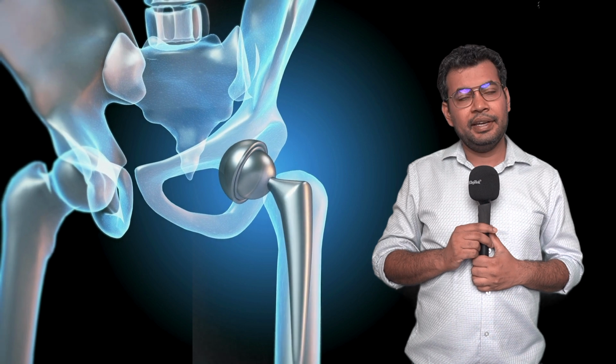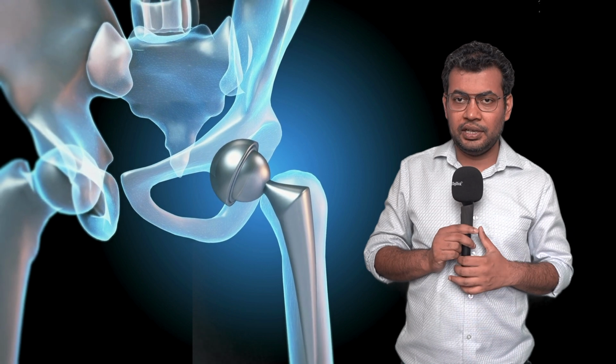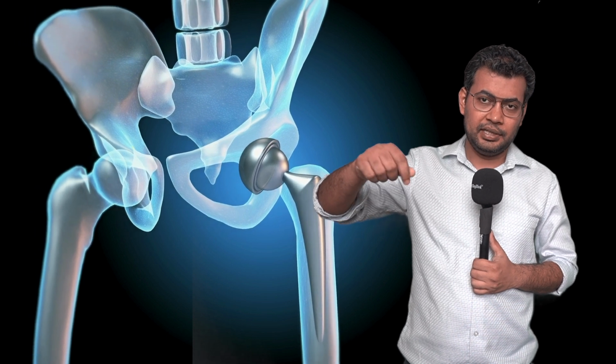Here we can take the bone osteotomy. Let's say, for example, we have a resection length of around 21 centimeter. We measure the 21 centimeter from the tip of the GT. We take an osteotomy of the femur here, and then we can easily hold the distal part of the femur with the bone holding forceps, and we can easily rotate the femur.